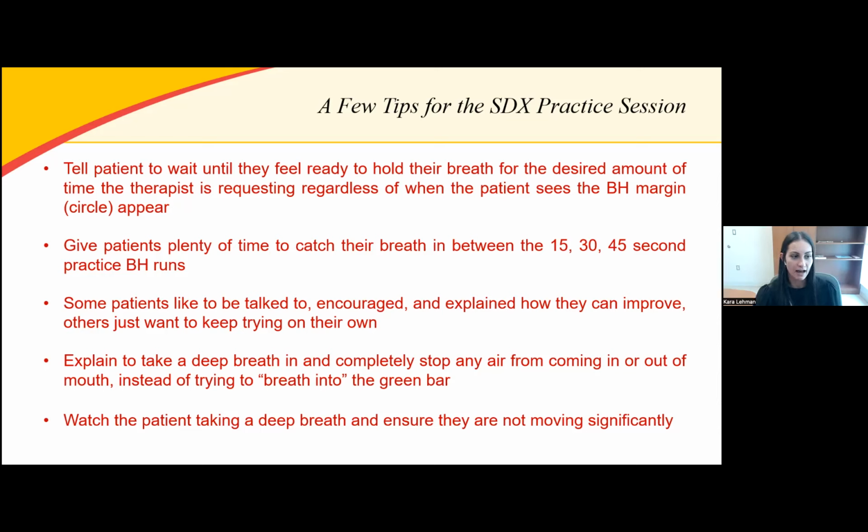And then the next point I have is to explain to the patient to take a deep breath in and completely stop any air from coming in and out of their mouth, instead of trying to breathe into the green bar. I'll explain a little bit more of what I mean with this in the next slide, but you really want to make sure that the patient is taking a deep breath in and completely holding their breath, because that is the point of using this SDX breath hold technology, to ensure that the tumor is not moving as much as possible.